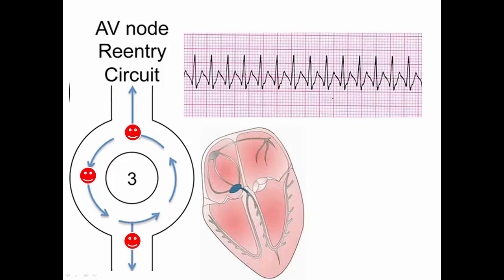Every now and then, and let me just draw it out really quickly, you can see them. Okay, what I've done is I've drawn out sometimes what you can see, and if you notice these waves here, a lot of times those are actually those upside down P waves that you can see there. And sometimes you can see them and sometimes you can't. If you can see a P wave in SVT, it's usually abnormal. Most of the time you can't see the P waves, but if you can, just remember they may be abnormal.